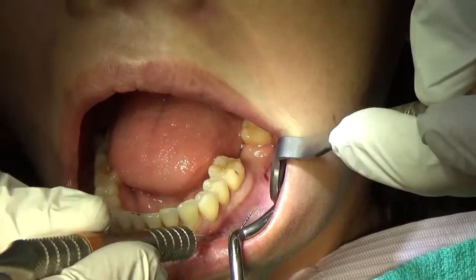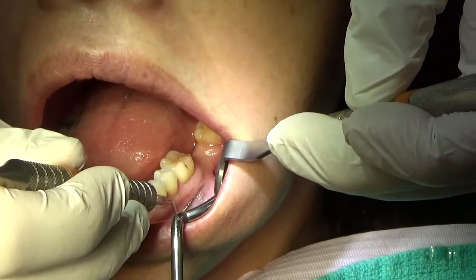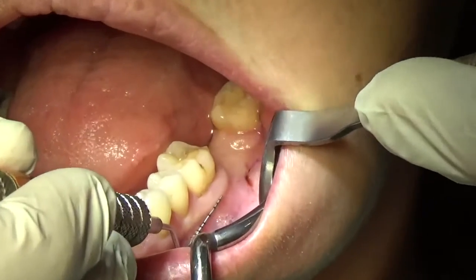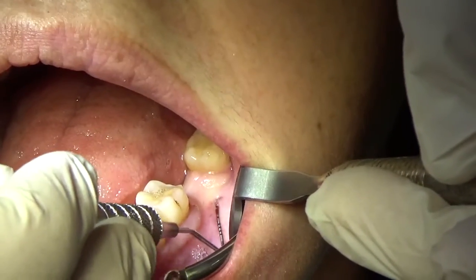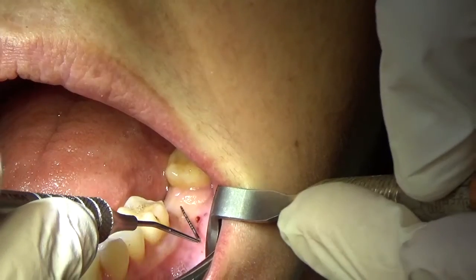This is exactly what I do for patients: I take a probe like this and I show them how we can move this tissue, but we can't move this tissue. So we've got this nice seal here. And as we go towards the edentulous area, we can start to see that seal goes away. So we've got a bit more mucosal tissue as it makes kind of a V into here.